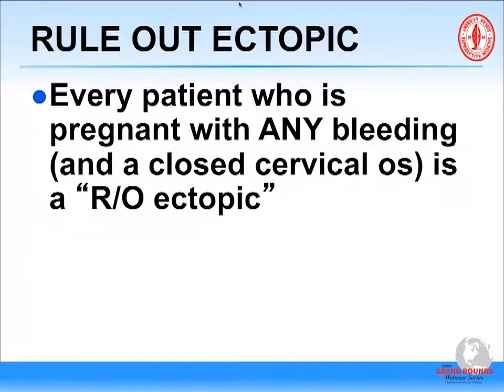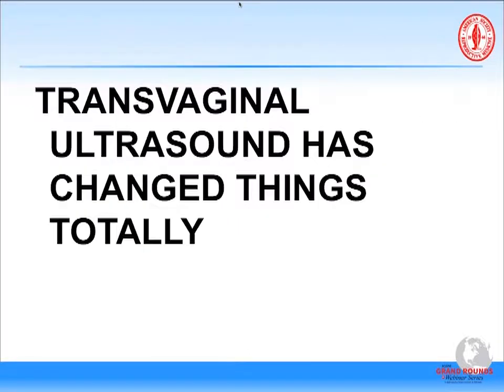In addition, we talk to our residents about the fact that any patient who is pregnant with any bleeding, and that's what really defines a threatened abortion, but any patient with any bleeding and a closed cervical os is a rule-out ectopic, is potentially an ectopic pregnancy until proven otherwise. So transvaginal ultrasound has changed things totally.